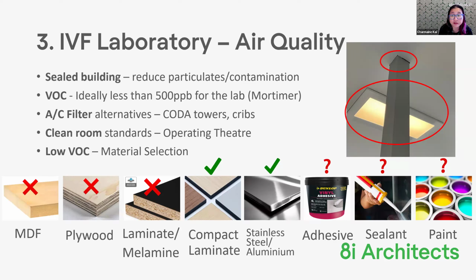Silicone's quite good in terms of VOCs, because what's going to happen is ceiling spaces tend to be quite dusty. You can get vermin in there, you can get a lot of dust buildup. It means that those things will actually get pushed into the lab, which is what you want to avoid.